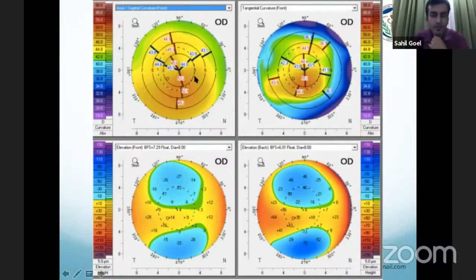After you have read the corneal curvature, the Kmax, that is the maximum keratometry, the inferior superior asymmetry, and the astigmatism, next in a quad map, you can jump to the elevation maps, whereby it is essentially an imaginary sphere, or what we call a best fit sphere, and every point is calculated by how many microns it is above or below that imaginary best fit sphere.